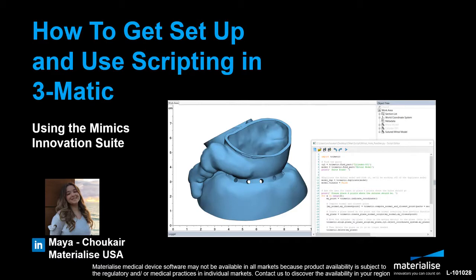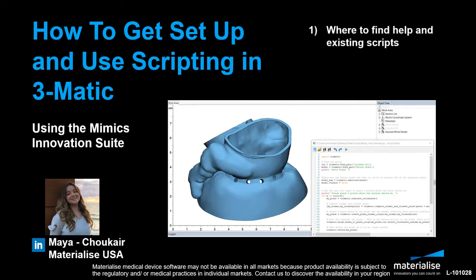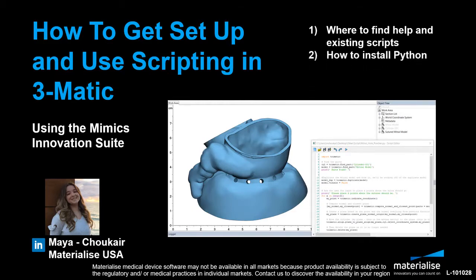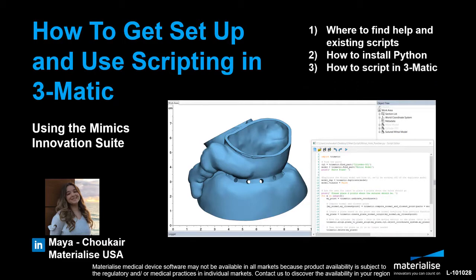In this video, I'll walk you through how to get started with using the scripting module as a beginner. We'll first go through where to go for help and where to find existing scripts that you can take advantage of. Then I'll show you how to install Python and get your system set up properly. And finally, we'll talk about what the best practices are for scripting in 3Matic and in general.